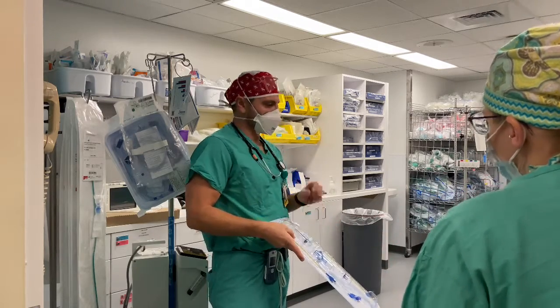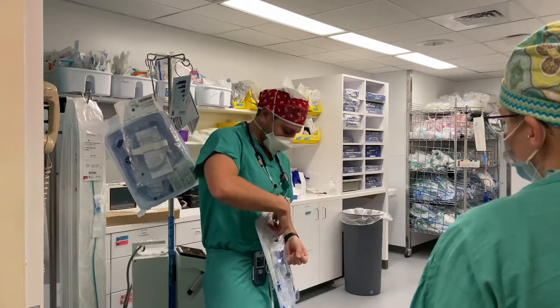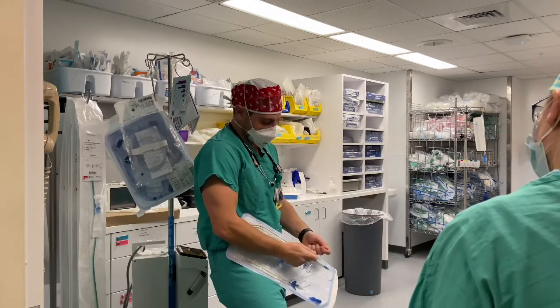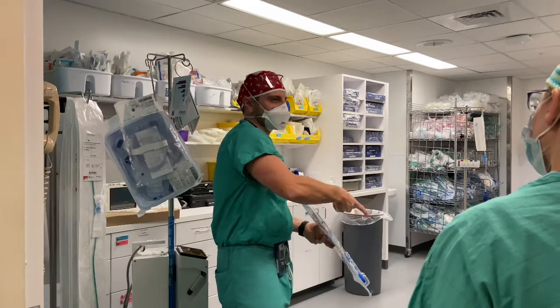Hook all of this stuff up before you ever hook it to the patient. Okay, so take this thing out, put the blocker down here, take a fiber optic scope, and with your hands, take the end and put the loop over the end and tighten it down, and then hook it up to the patient and try to drive it.